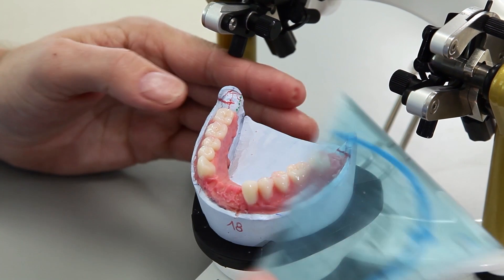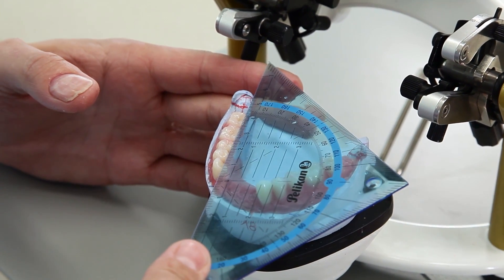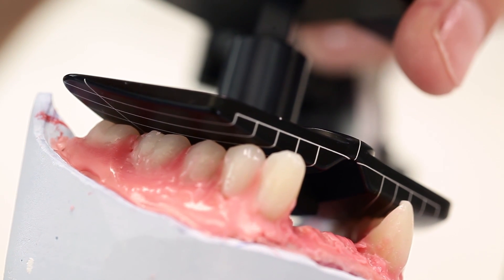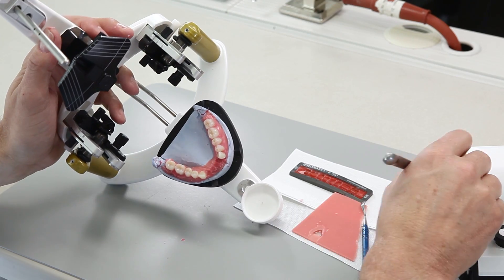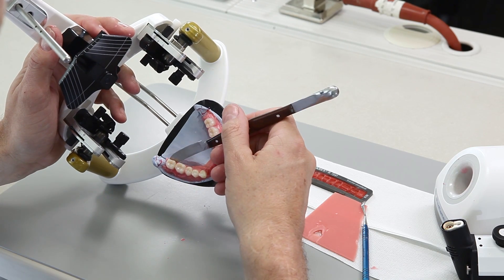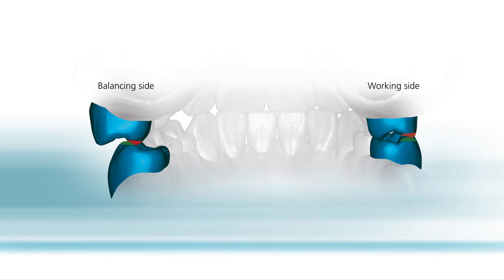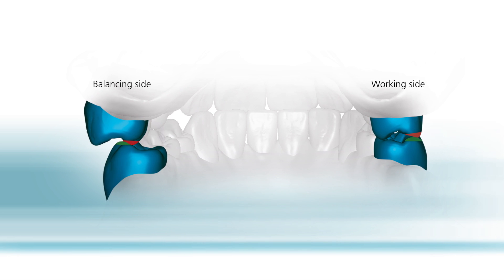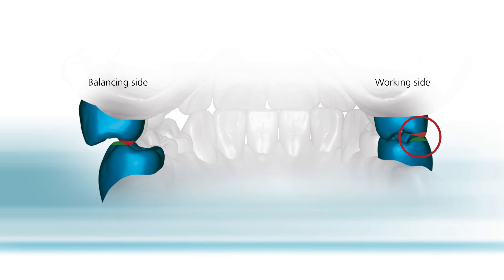Check whether the teeth are correctly positioned within the functional corridor. The line system of the template facilitates the symmetrical setup of the posterior teeth. Nevertheless, there is a certain range of variation. The type teeth from Ivoclar Vividend implement the concept by Dr. Strack. It's based on the simultaneous group contact both on the working and balancing sides.